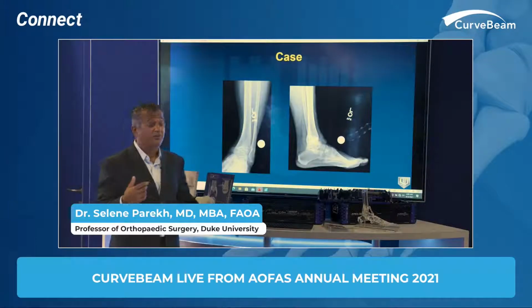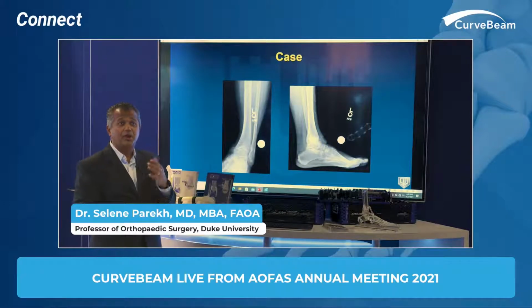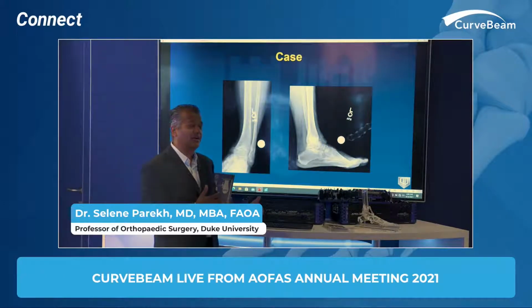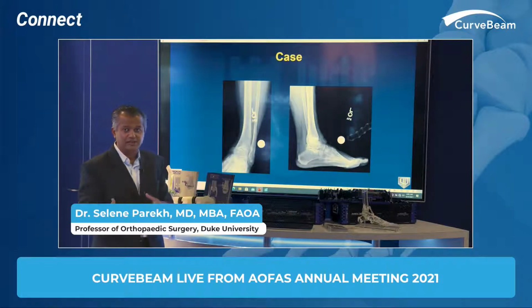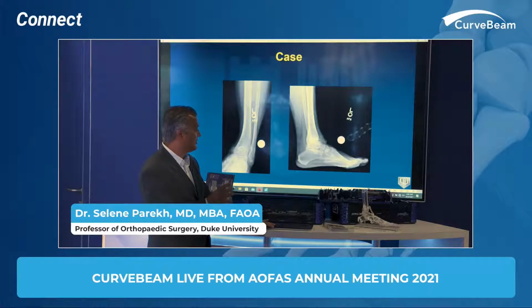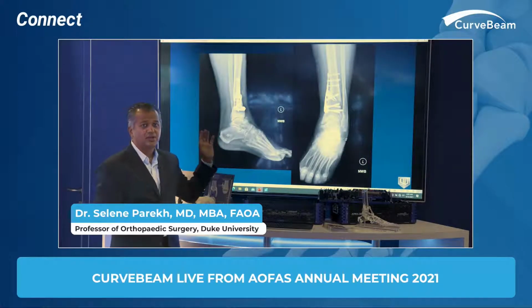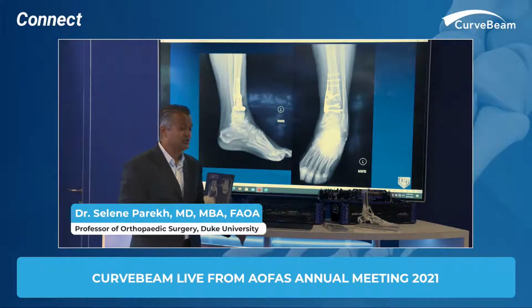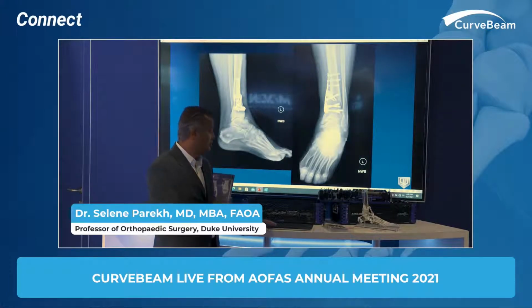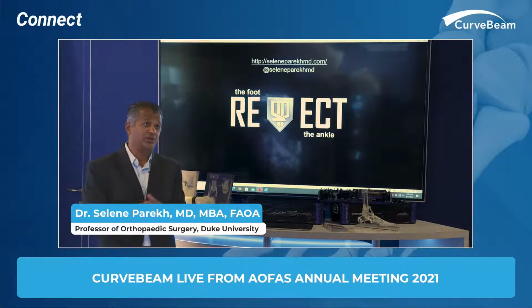In addition, for patients who have supramalleolar deformities, the weight-bearing CT scan gives you a lot of information on how much deformity you need to correct. Again, with Paragon and PSI, you can then create cutting guides to create the cuts, create a cage, a medial plate, correct the deformity, and get these patients better alignment, which hopefully translates into longevity to their native ankle and allowing them to hopefully avoid a total ankle replacement.